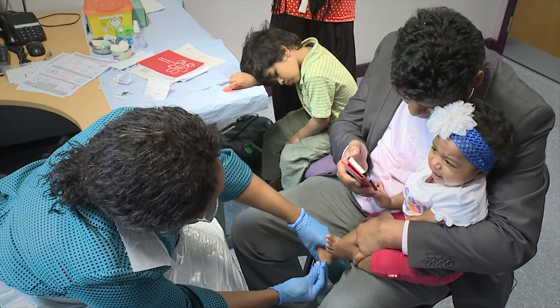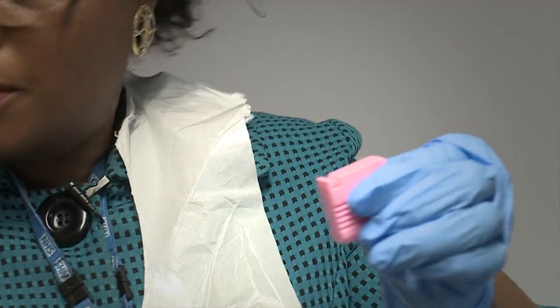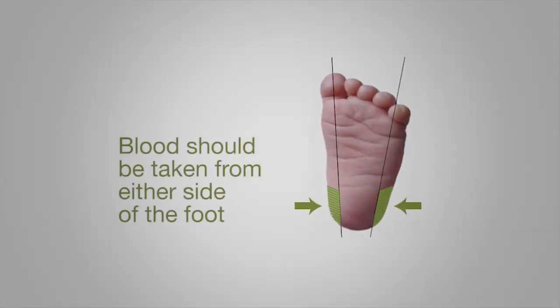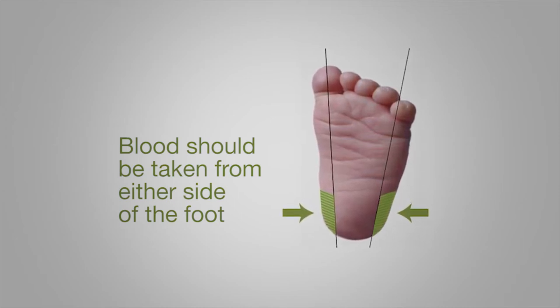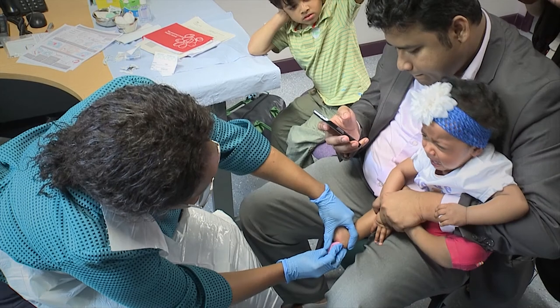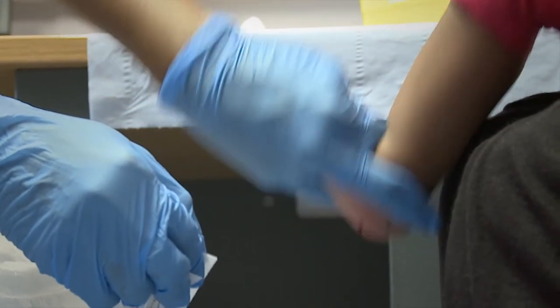Clean the area with an alcohol wipe and leave this to dry for a few seconds. Remove the blue safety clip from the lancet device. When taking a blood spot sample, avoid the back of the heel. Blood samples should be taken from either side of the foot as shown in the diagram. Place the lancet device in light contact with the area to ensure the incision is not too deep or too shallow.